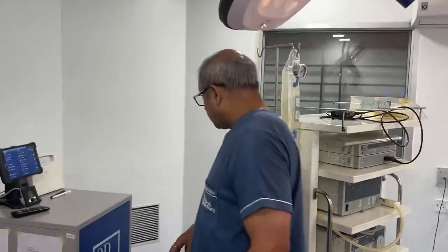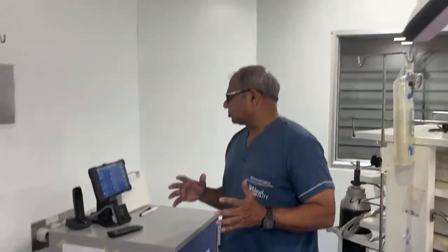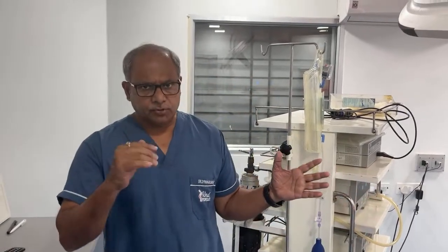So this is basically an advanced endoscopy system. We do laparoscopic surgery in this lab, and we do hysteroscopic surgery in this operation room, and if the patient wants to see what is happening inside the operation room, we can show them live while talking to them, in 4 zones.